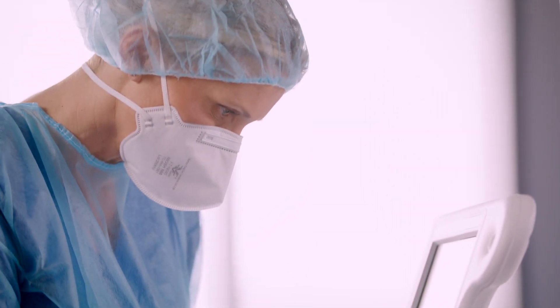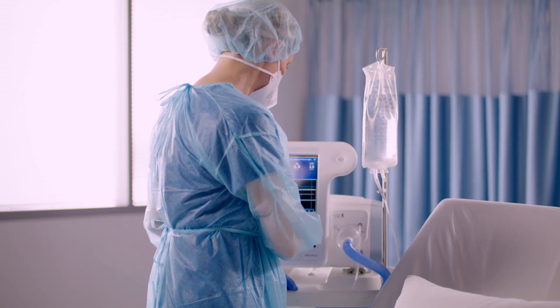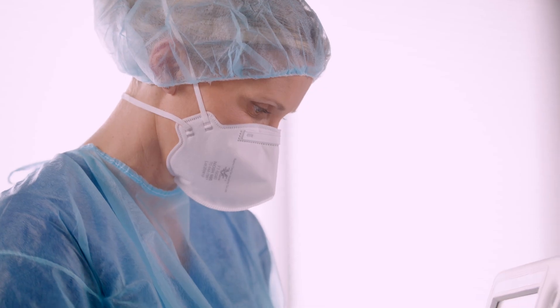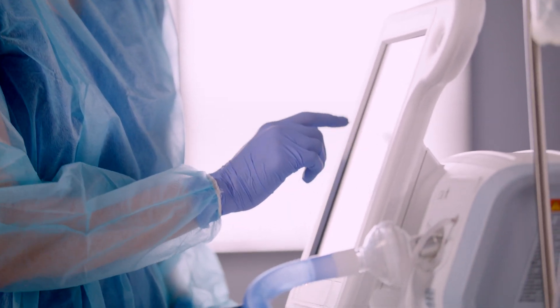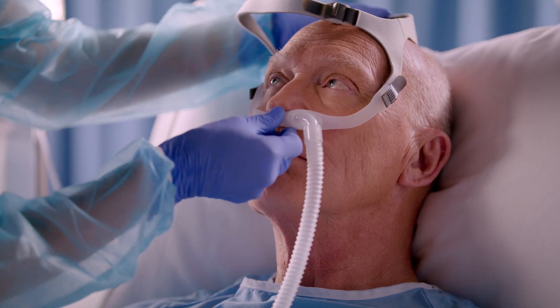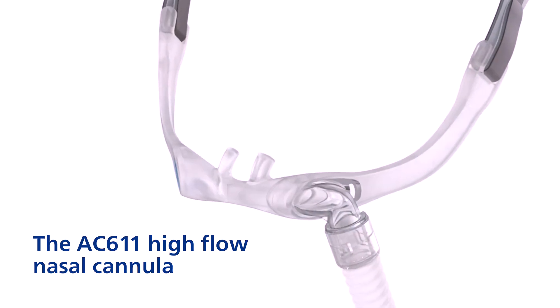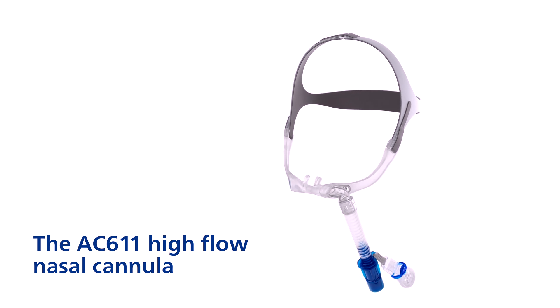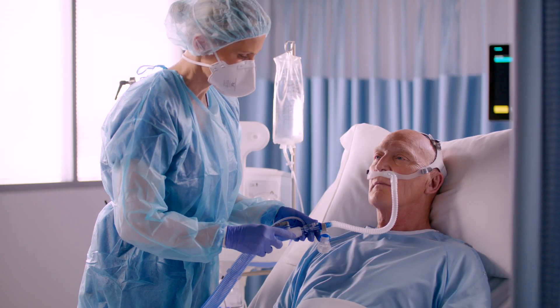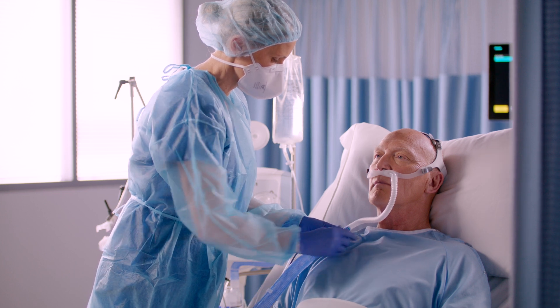HFT functionality is available in either a new V60 Plus ventilator or as a field upgrade to your existing V60 device. The key to successful use of HFT on the V60 Plus ventilator is the Philips AC611 high flow nasal cannula. Used together, they are capable of high flow rates up to 80 liters per minute.